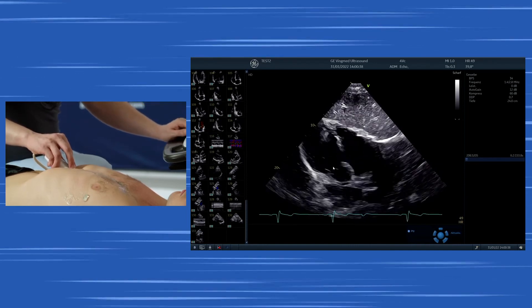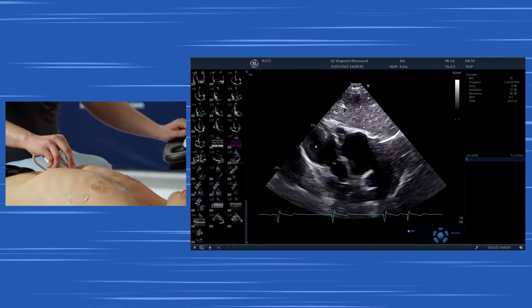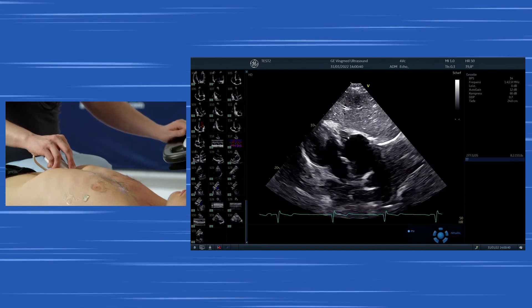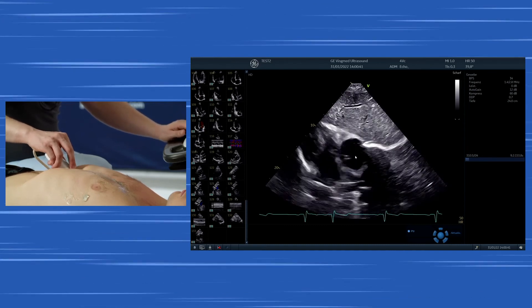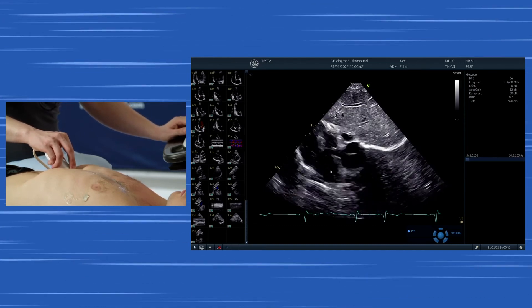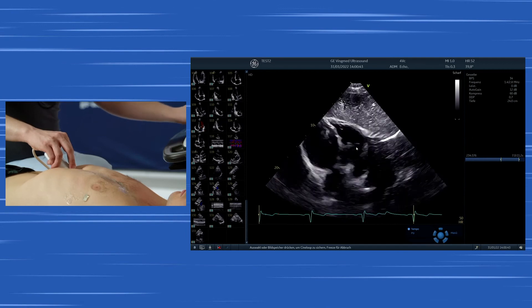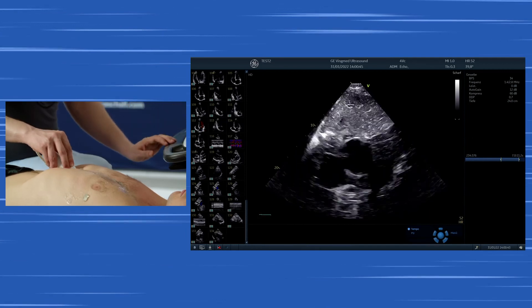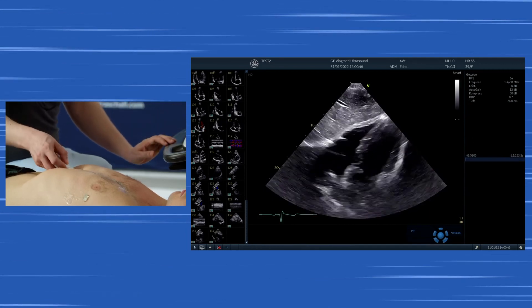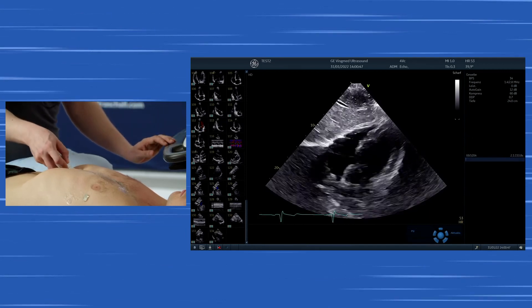This is the aortic valve, this is the left ventricle, and this is the right ventricle. You can differentiate those structures just as you would from a parasternal approach, but here from a subcostal approach.